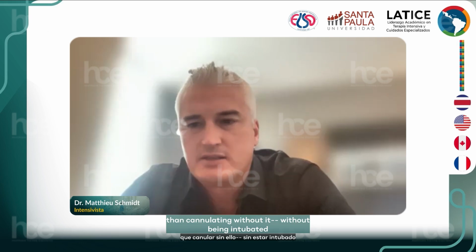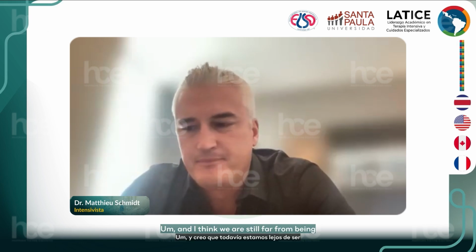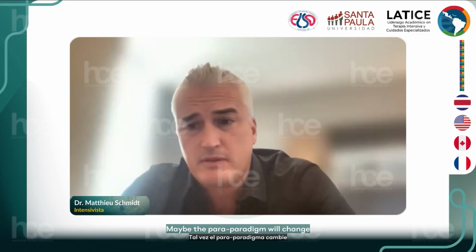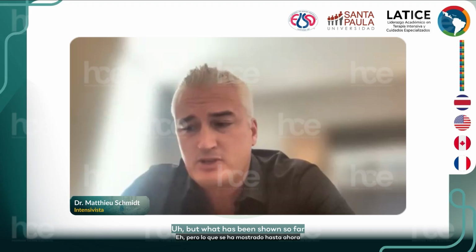Yeah, I agree with Cara. I think extubating on ECMO is probably easier than cannulating without being intubated. And I think we are still far from being able to cannulate a patient without being intubated. So maybe in the future we will see it. Maybe the paradigm will change. But what has been shown so far is that it's feasible.